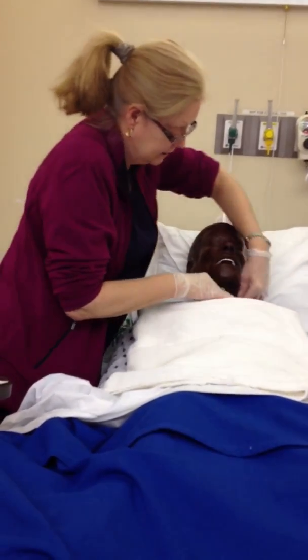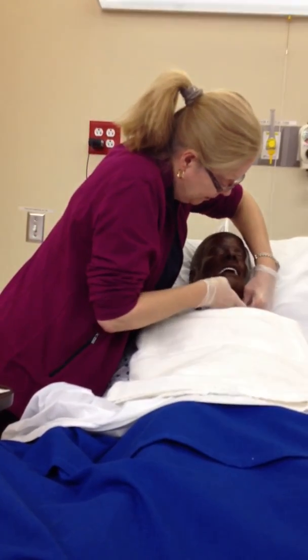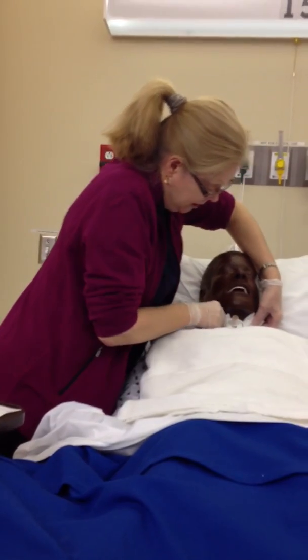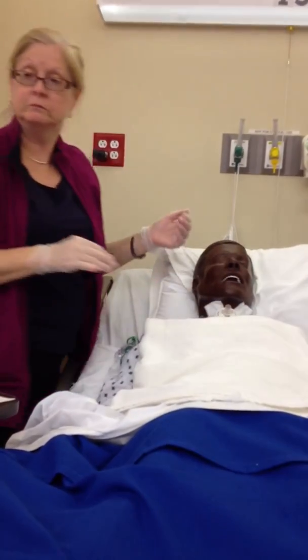I have a question. Okay. Would it be uncommon to see drainage from that area after you're looking at that site? Oh, yeah. There's usually a lot of drainage. After you take the gauze out, will there still be drainage coming from it? Could be, yeah. It depends. Sometimes you get a trach patient and they're in with pneumonia, and they produce a lot of sputum just because of the infection, the respiratory infection.